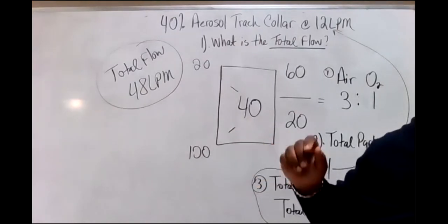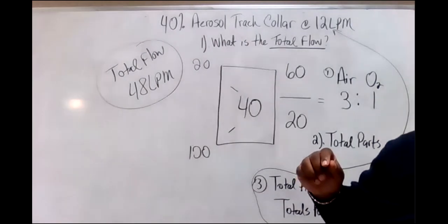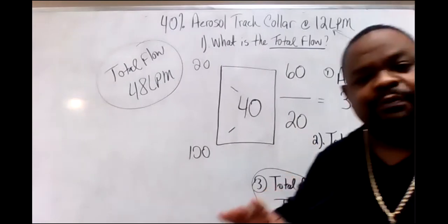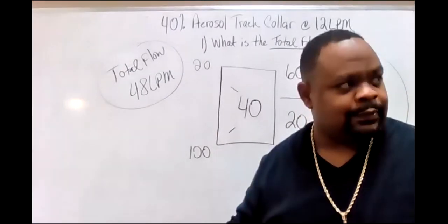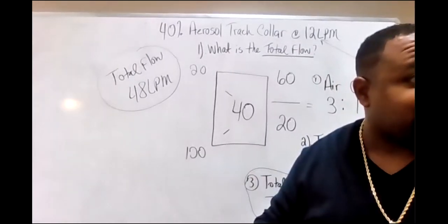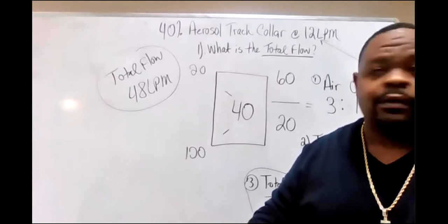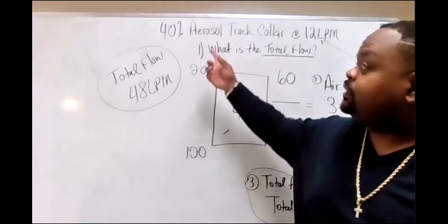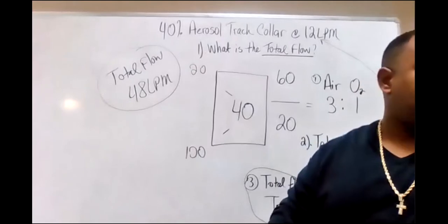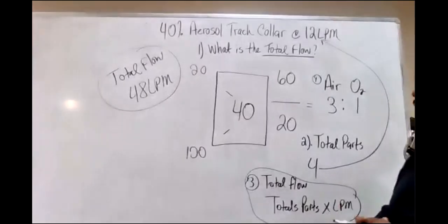Now, am I meeting the last man's demand? What was his demand? The last patient, Mr. Smith. Listen to me, guys. I said his demand. No, we're not meeting it. He demanded 57 liters per minute. Remember that? He said, I've got to have 57 or you can go find somebody else to play with. So he said he needs 57. The device that we gave is only giving 48. So are we meeting his demand? No. So in order to meet his demand, what has to happen?